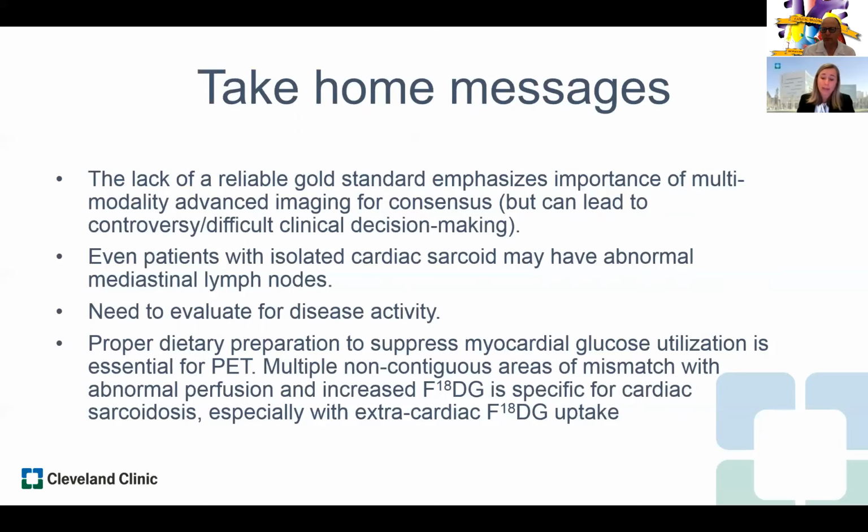And as I've alluded to, make sure that you discuss these patients with your imaging experts so that they're well prepared if they do go on to have a cardiac PET, so that you get the most information that you possibly can. So I think this is a really interesting disease process. We're well placed with multimodality cardiac imaging to help you make the underlying diagnosis. And the importance of discussing these patients with your imaging specialist cannot be more highly recommended, to make sure that we do the right testing for the right patients.